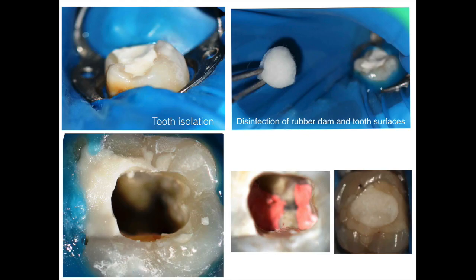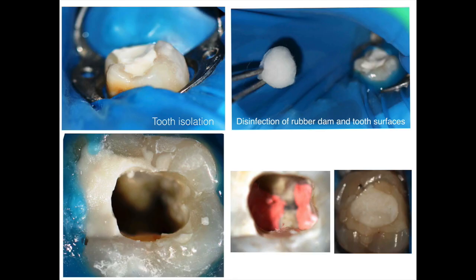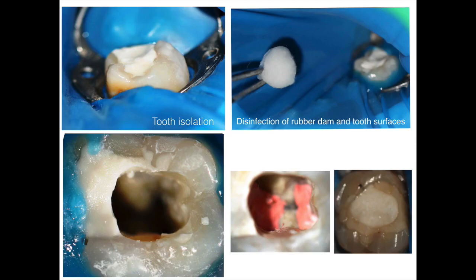You've done your instrumentation, cleaned up completely, and obturated using hydraulic condensation. By the way, this is my first case with BC sealer. I can see there is sealer all over the floor of the chamber — the trick is to cut one or two millimeters higher using heat, then condense it. That button of gutta-percha above the orifice level acts as melted material that you can pack with a thick plugger — like a size 10 — giving you a nice flow of material up there.